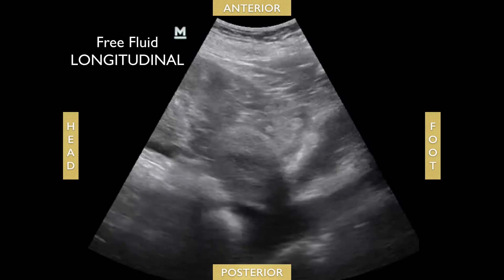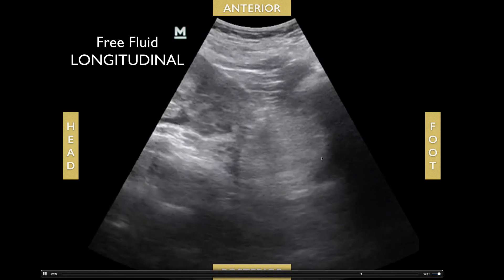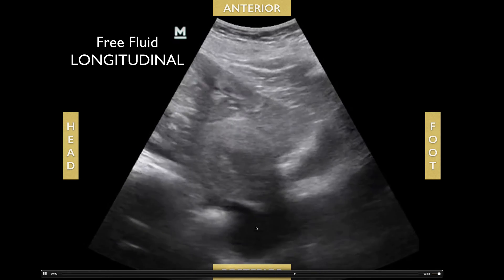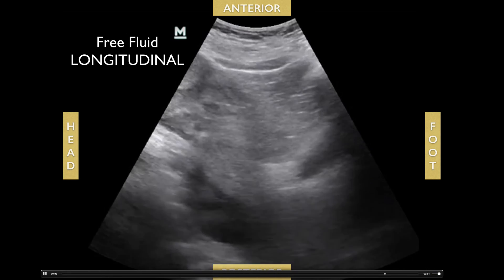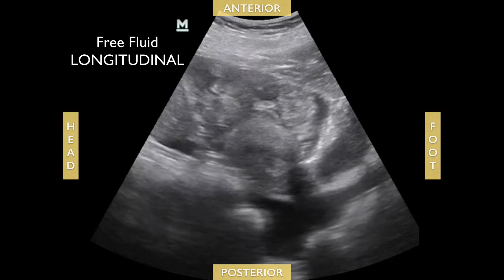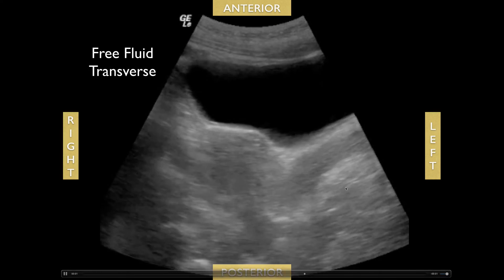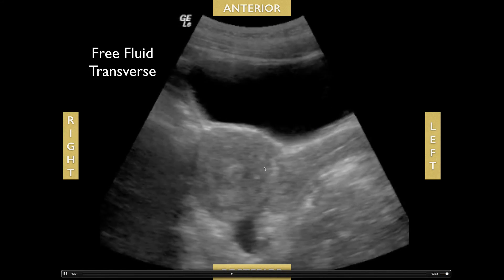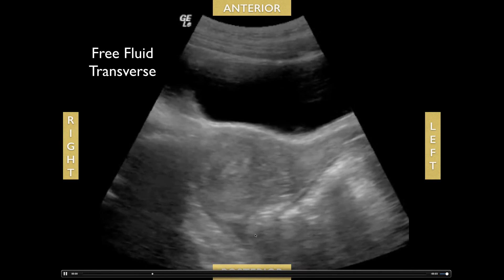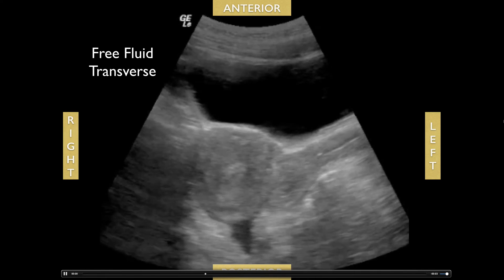Here are some abnormal views: you see the uterus, the bladder, and an anechoic area right below the uterus indicative of free fluid. In another transverse view, you can see a small amount of free fluid lying posterior to the uterus.